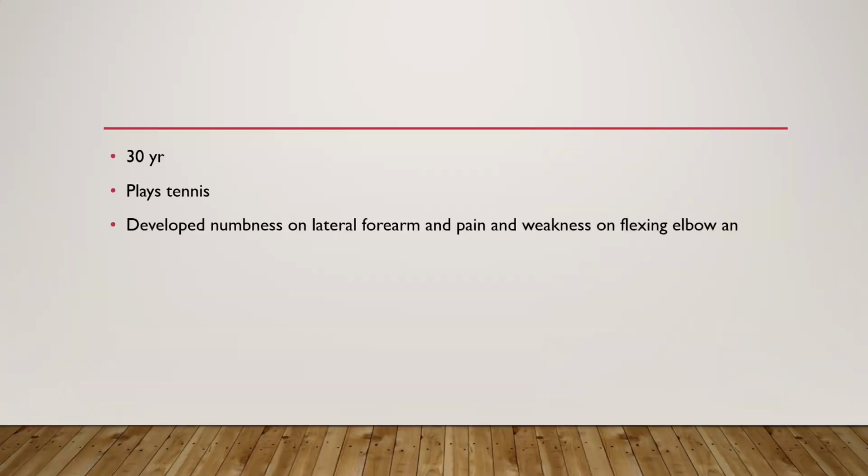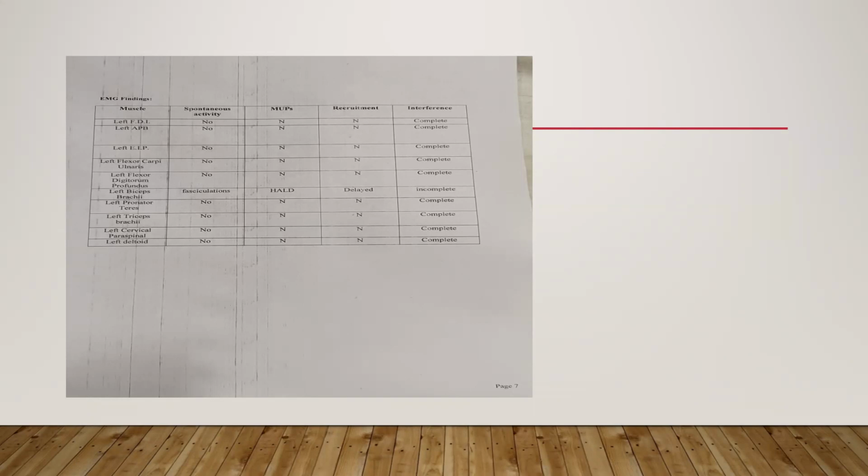So can any SNAP be abnormal in the musculocutaneous nerve? Lateral cutaneous nerve of the forearm, ma'am. So LABC, na? If you do the LABC and you find the LABC abnormal, then it goes more in favor of musculocutaneous nerve than C5, C6. Yes, ma'am. Okay, sure.